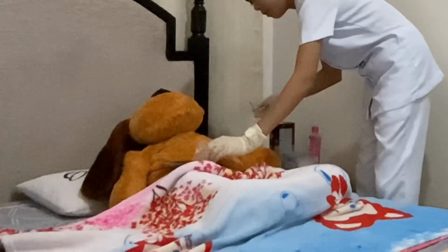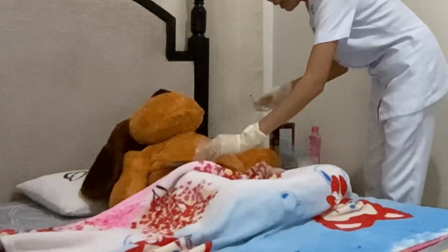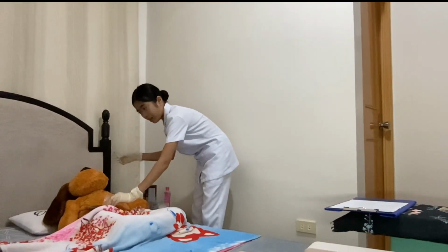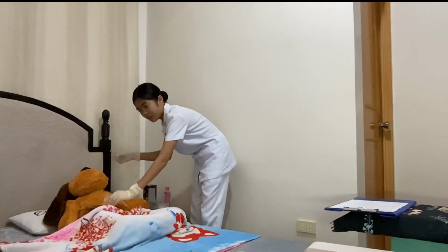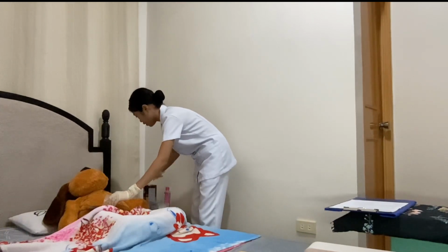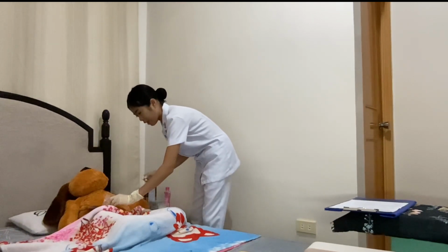Since I am having difficulty trying to put back the cap of the syringe by using the fish hook method, I'm going to dispose of it in my trash receptacle. Like that.